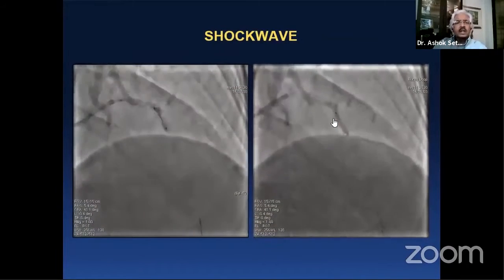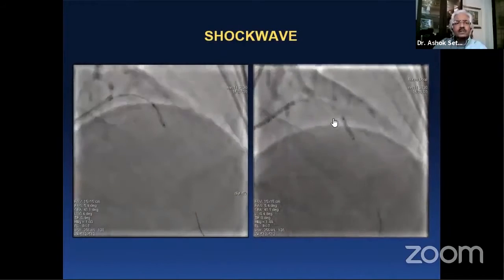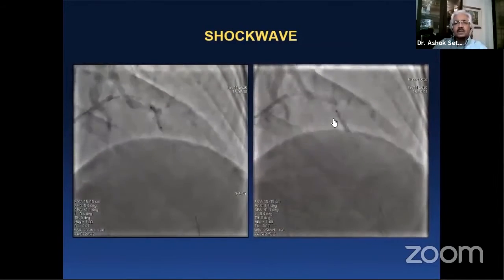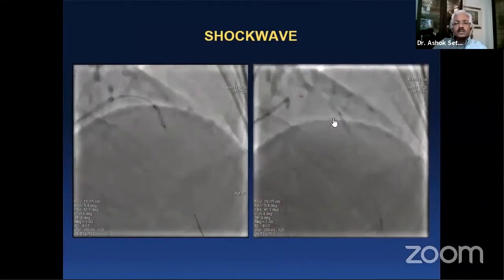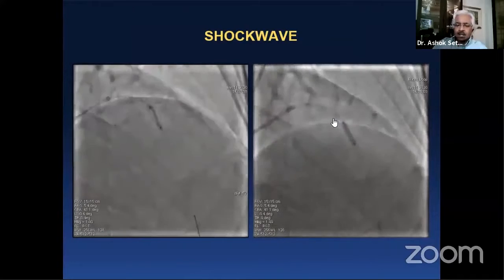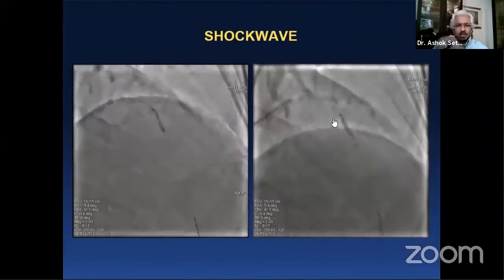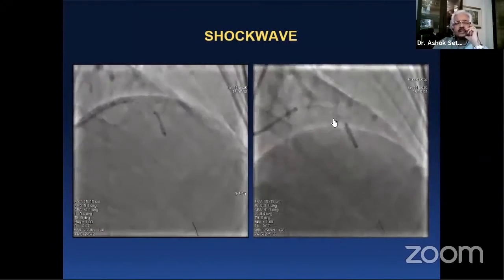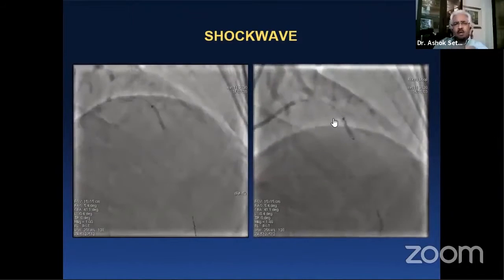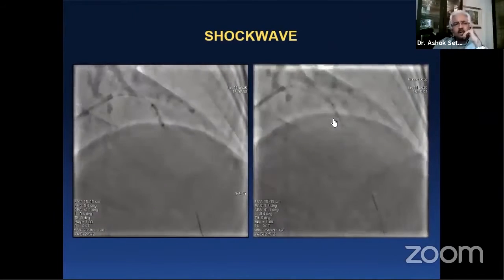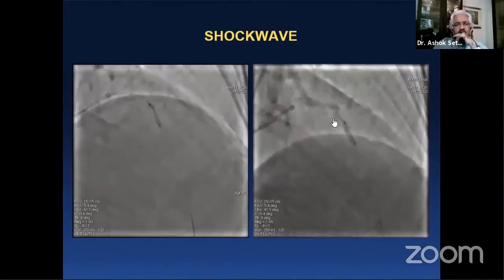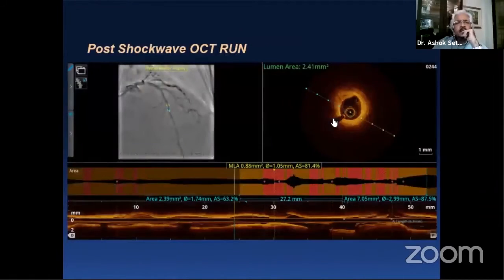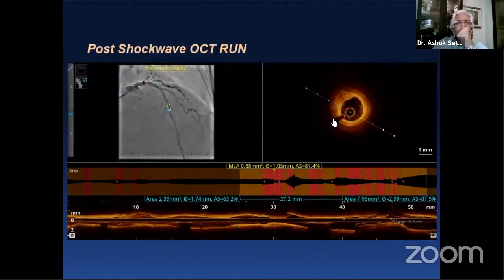You can see the balloon at four atmospheres, and as you see on the right, the balloon opens up at low pressures after delivery of — I think it was 10 pulses in this case. The whole vessel was then given another 40 pulses up and down.